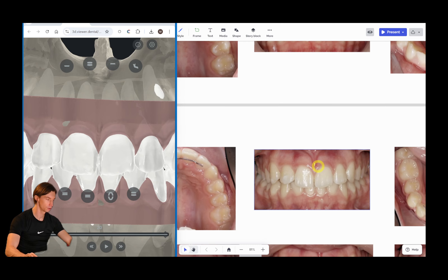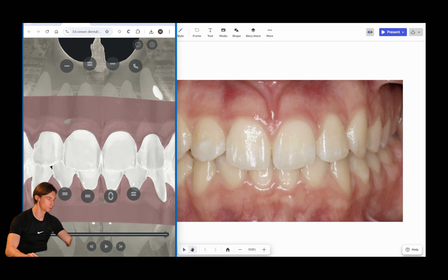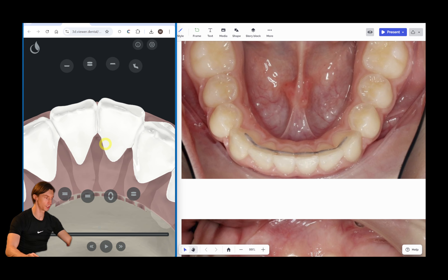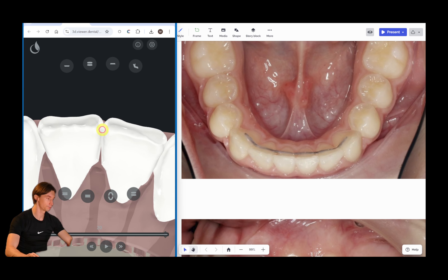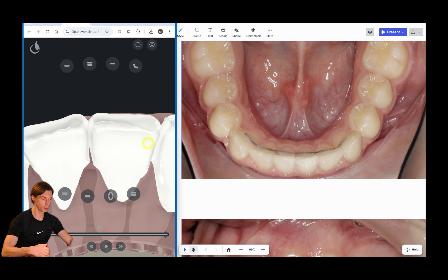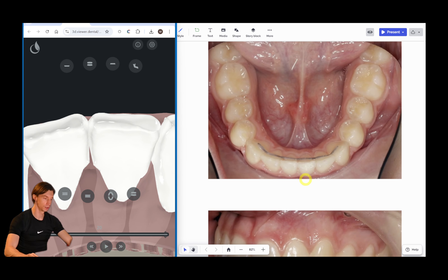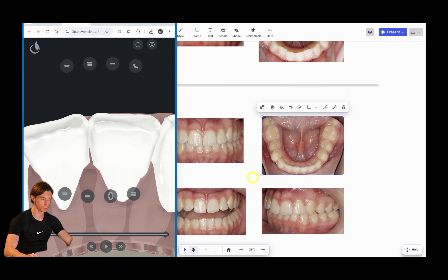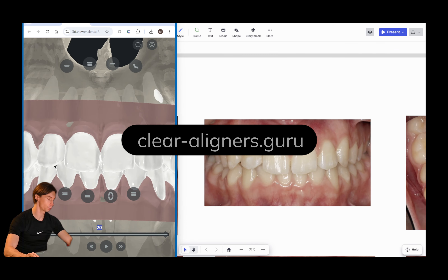Let's have a look at the photos — this is our final position and this is the final result. Since we had these two central incisors placed more vestibularly compared to the neighboring lateral incisors, we had to set up their final position with some overcorrection, placing them more lingually. Because as we know, aligners have some lag and the teeth will not be properly aligned otherwise — in such cases you always have to overcorrect the position of the teeth. This case took us 20 aligners.